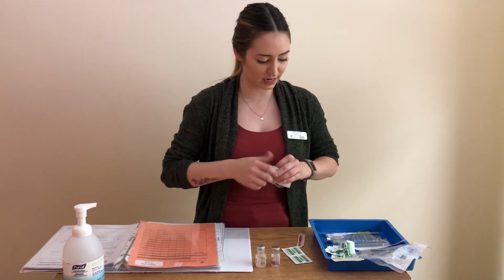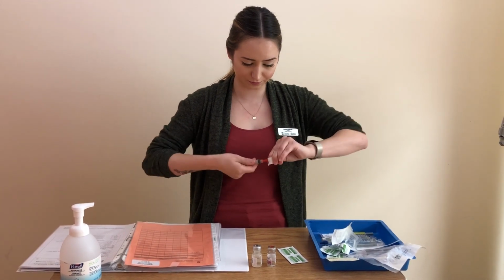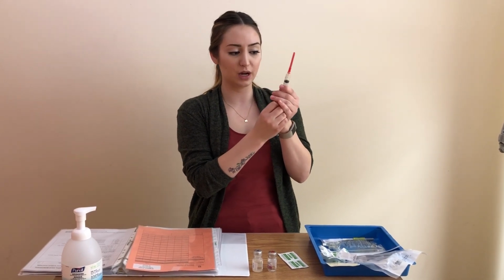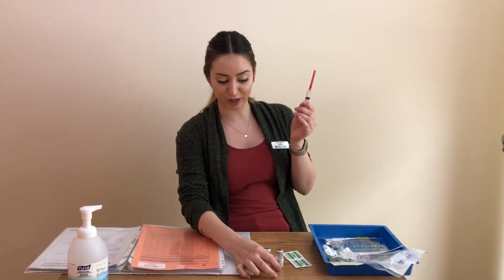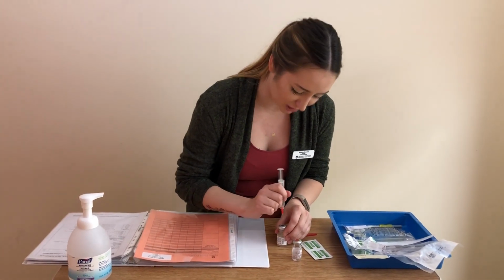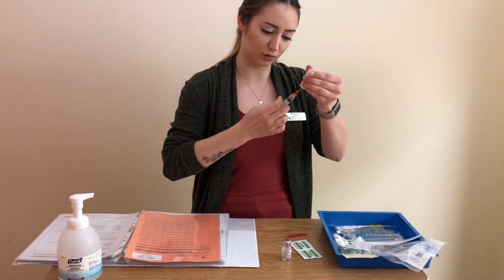Get my syringe ready. Okay, so as per the drug monograph, I need to reconstitute my medication with 2 milliliters of sterile water. So I am injecting 2 milliliters of air, pulling out 2 milliliters of the sterile water.